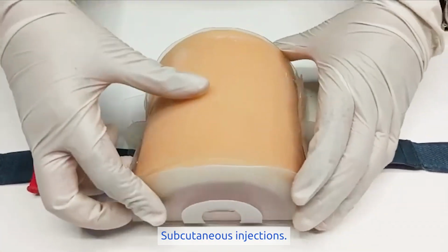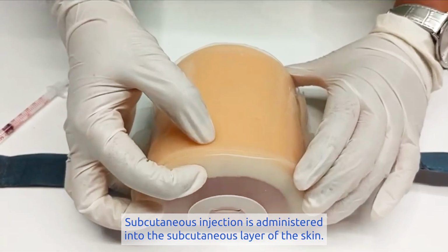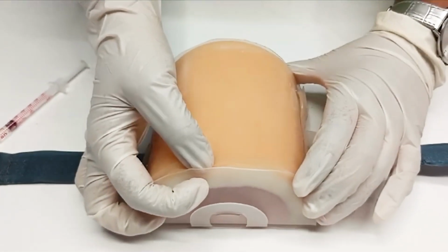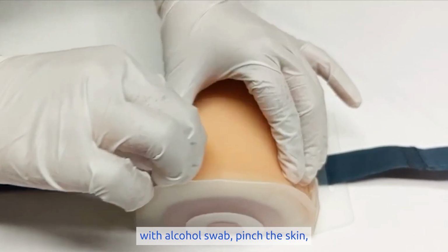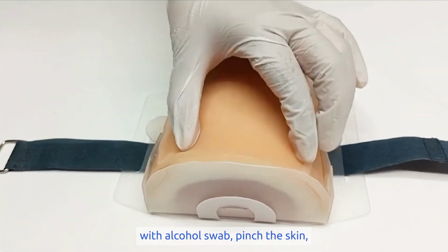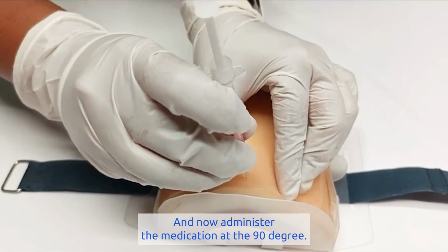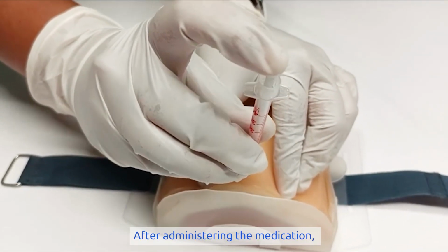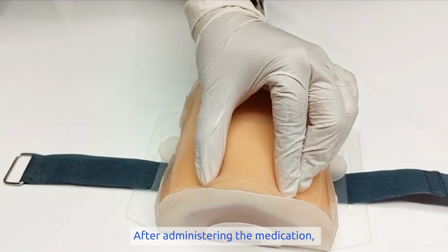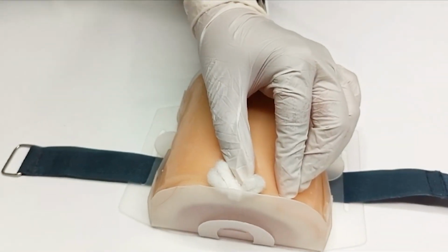Subcutaneous injections. Subcutaneous injection is administered into the subcutaneous layer of the skin. First, we have to disinfect the area with an alcohol swab. Pinch the skin and now administer the medication at 90 degrees. After administering the medication, withdraw the injection and press it with a cotton.